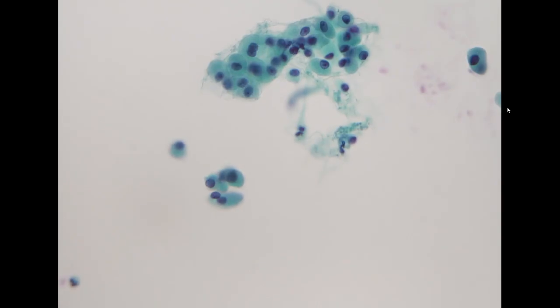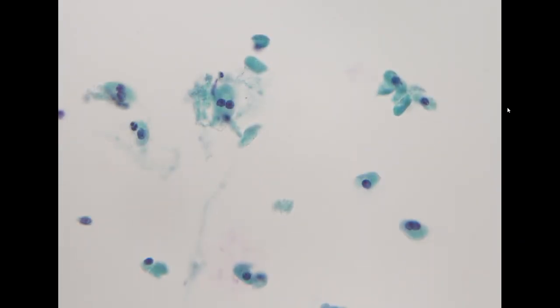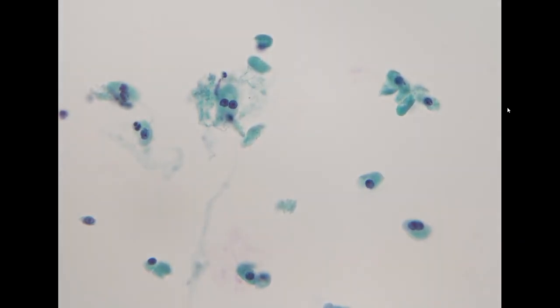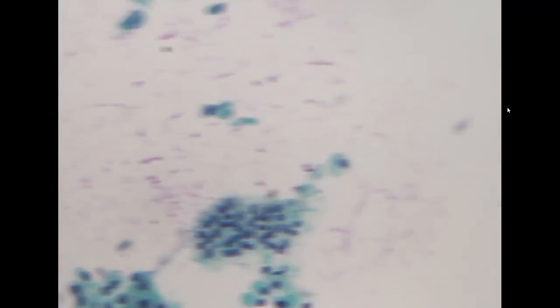We see some cellular fragments, and when we go to high power, the cells are composed almost exclusively of oncocytes, or Hurthle cells. So in the background of no colloid, and with a cellular aspirate composed of mostly or exclusively Hurthle cells, the diagnosis is TBS 4, suspicious for oncocytic tumor.